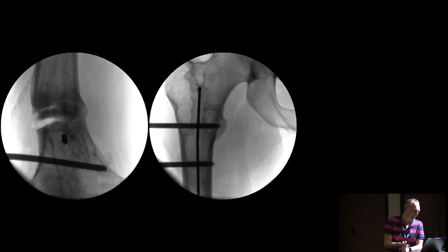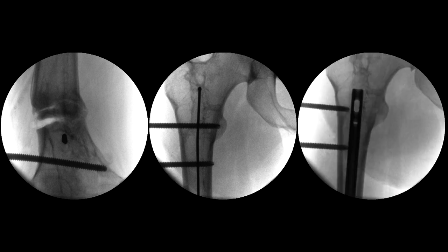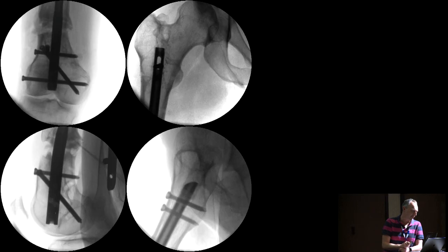Guide wire has been passed beyond, and we were quite pleased it did pass beyond. We quite carefully placed those Shanz screws, but it's more difficult to tell at the proximal end. It's more difficult to get a lateral radiograph, but it passed fairly easily beyond there. But we were a bit concerned when we passed the large reamers up that they may clash with the pins, and so we backed them out so they became unicortical at that point, and it retained sufficient stability.